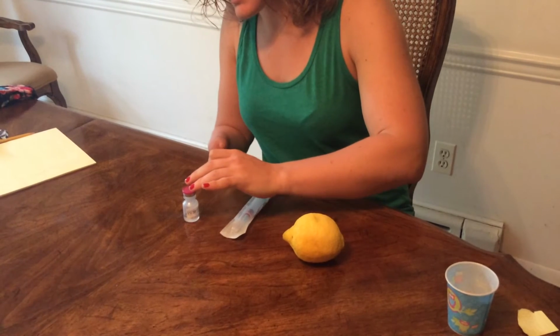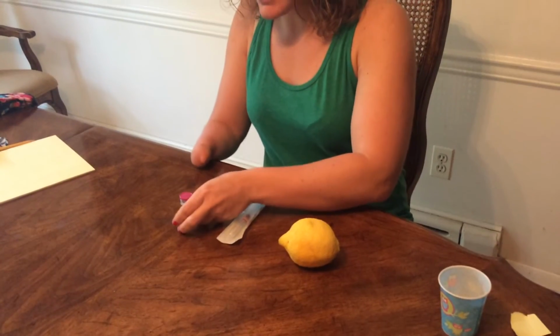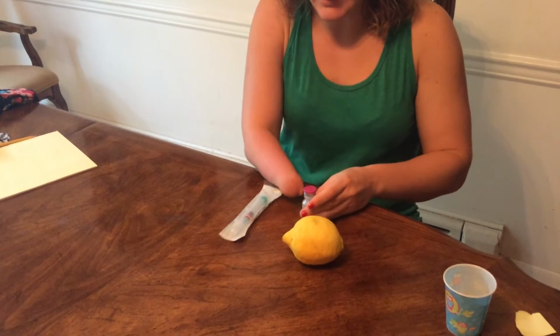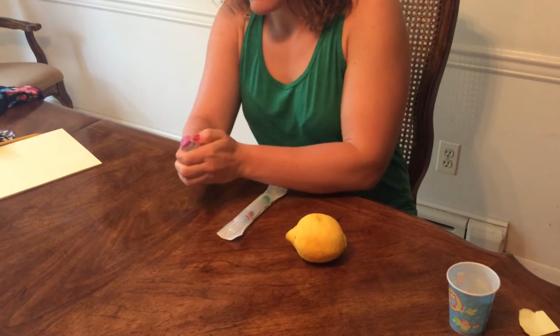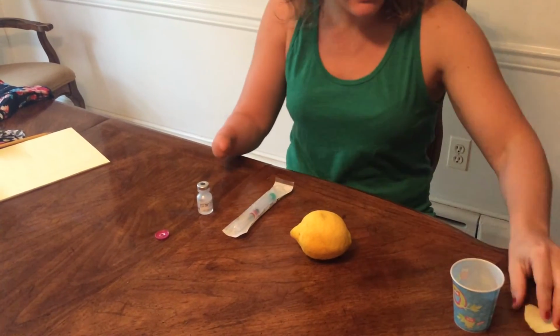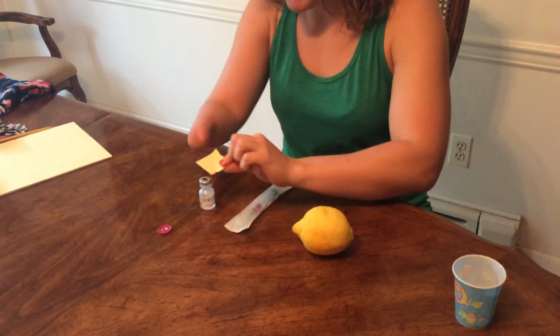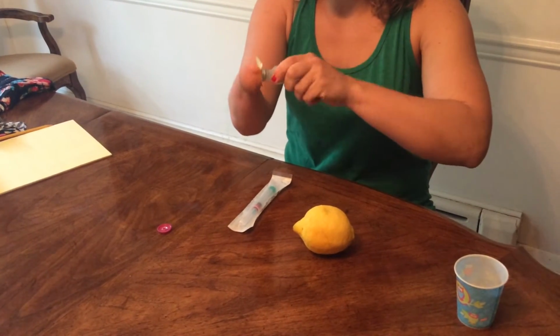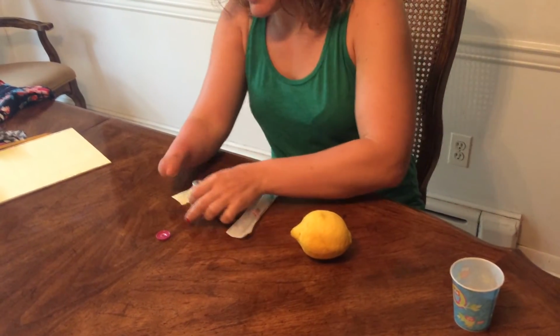So one of them is the top of this. So first things first, when the cap is on, what underneath it is sterile. So you pop it off, that's sterile. Now let's say the top wasn't on. We're going to just pretend this is an alcohol pad. You would take your hand, go 30 times with it, and then it's sterile.